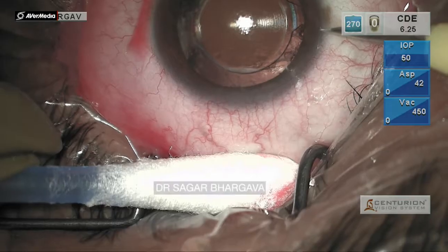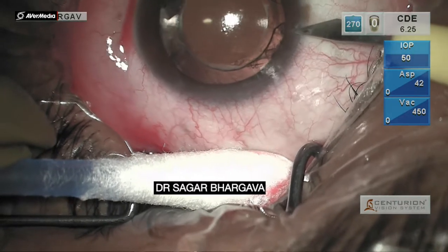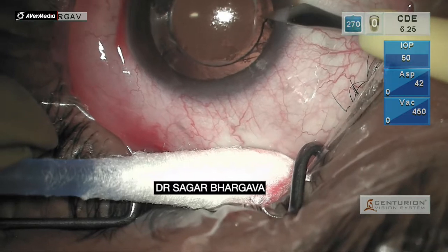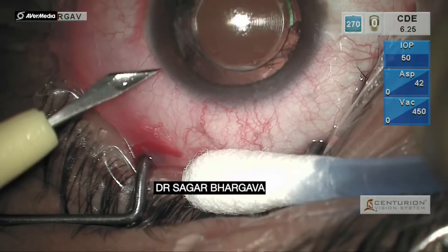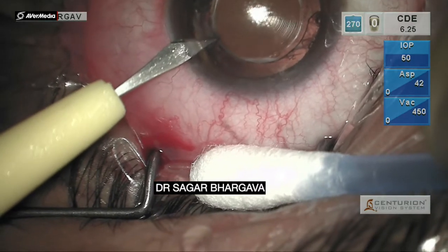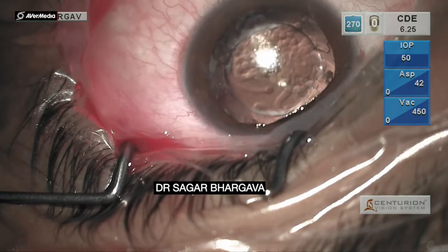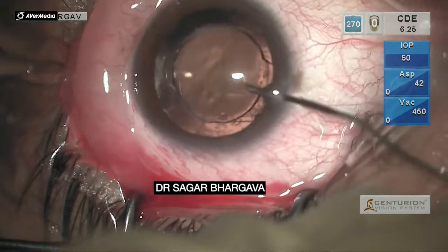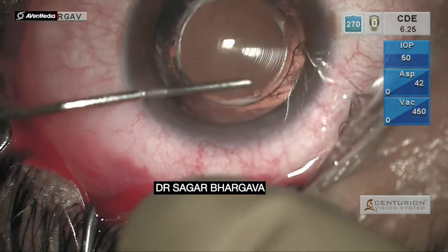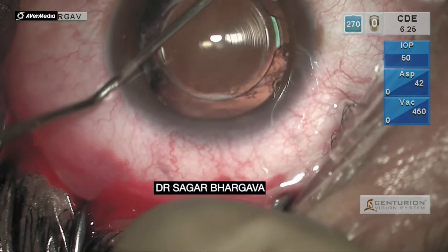This is how it looked on dilatation. You can see a nice trifocal IOL sitting in the back. Side port entries are made and viscoelastic is injected. A good amount of viscoelastic is also injected under the anterior capsule in the IOL bag to facilitate movement of the IOL.